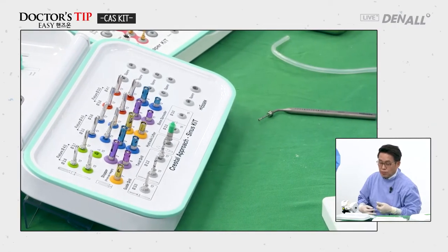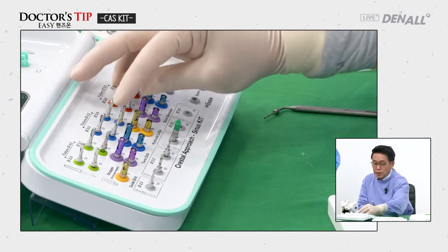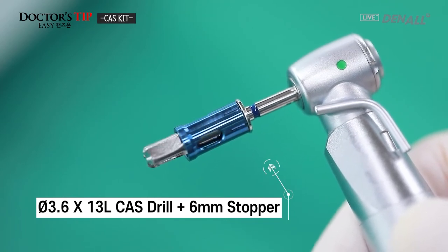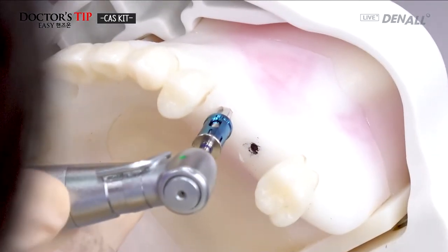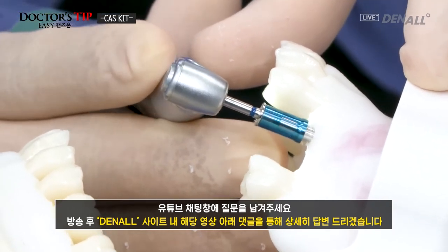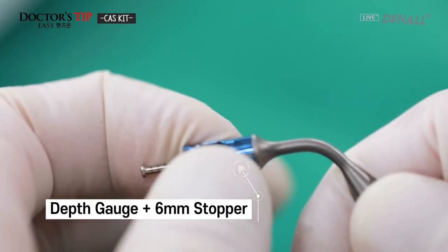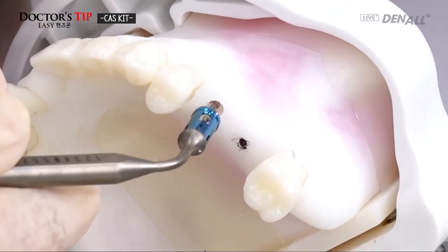Next, the 4.5 fixture will be installed. So the CAS drill diameter 3.6 is used. A 6 millimeter stopper is connected, because the sinus floor was not penetrated with the 5 millimeter stopper. The drill hole is not opened yet, so the depth gauge is connected with the 6 millimeter stopper to check whether the sinus floor is penetrated.